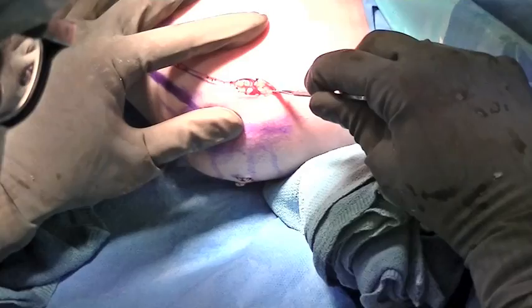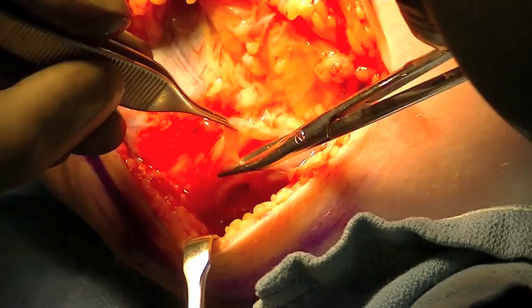Care is taken to identify the ulnar nerve. This is not transposed but is marked with a vessel loop and protected.